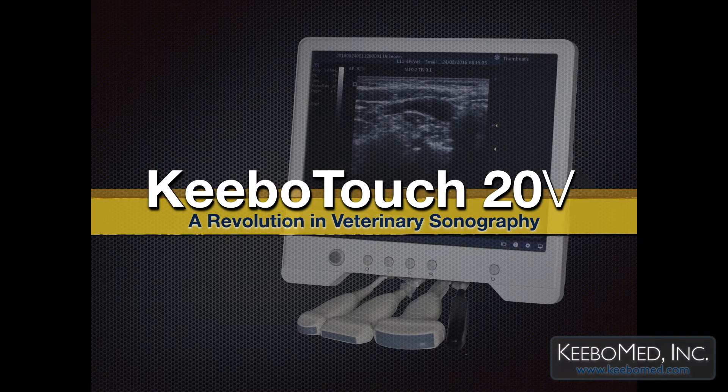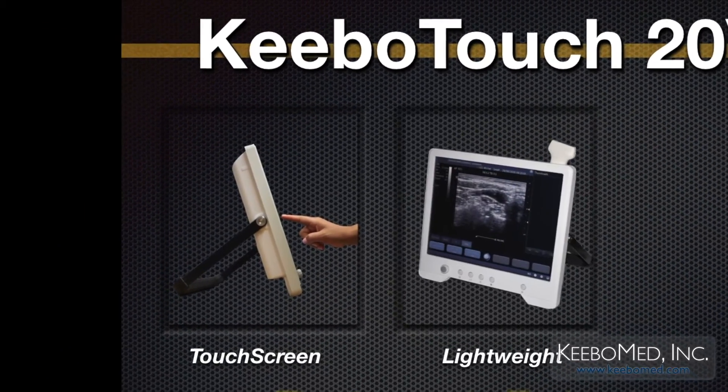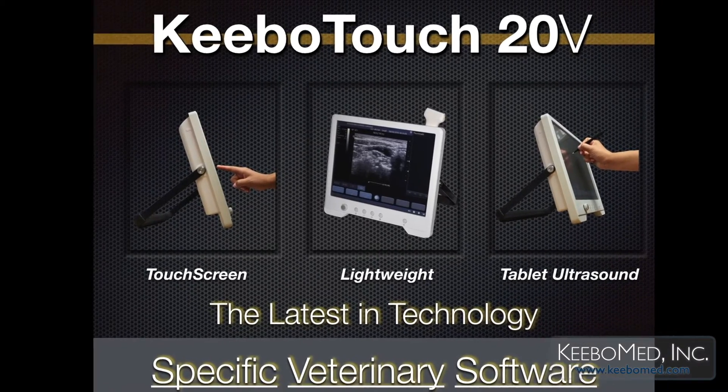Kibo Touch 20V — a revolution in veterinary sonography. It's a touchscreen, lightweight, tablet ultrasound. This ultrasound carries specific veterinary software.